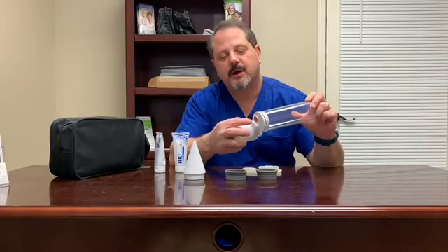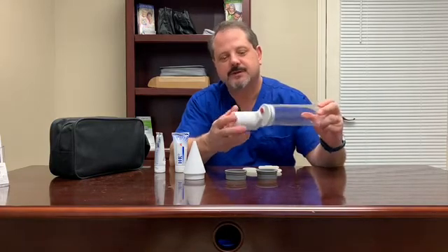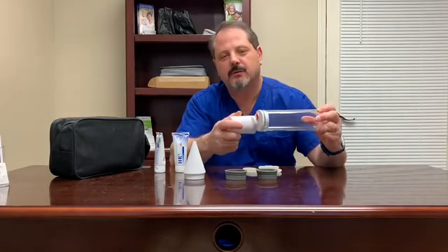It also has the relief button. If you pump too much or feel any discomfort, just hit that red button and that will release the pressure.